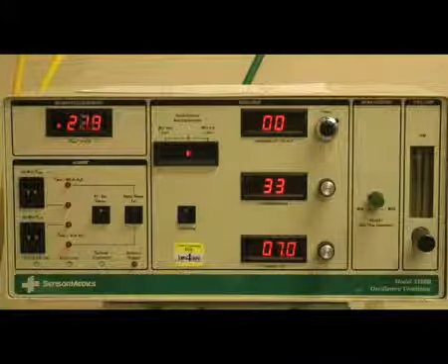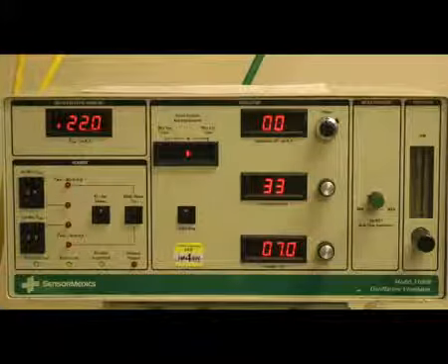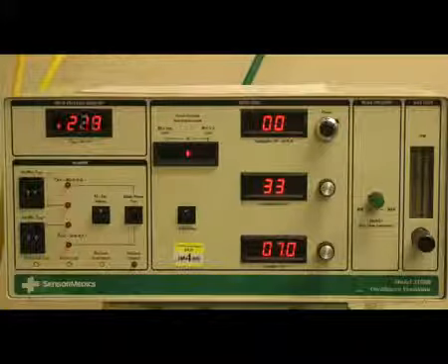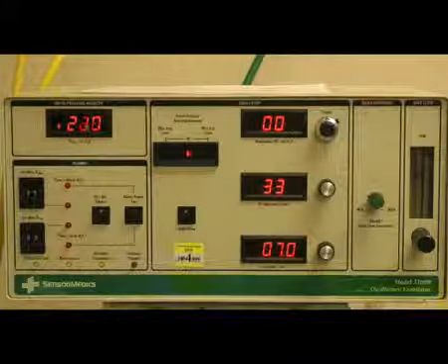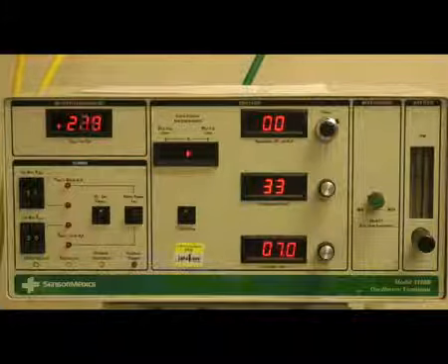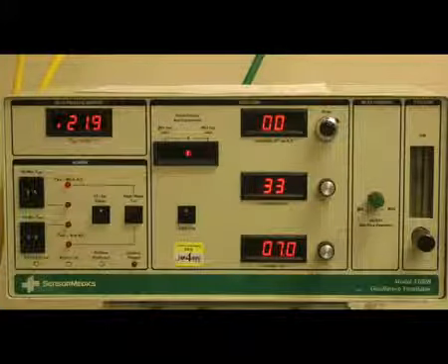However, before you begin, you need to ensure that you have met the indications for high-frequency ventilation. The indications are oxygenation failure, which is defined by an FiO2 of greater than or equal to 0.7 and a positive end expiratory pressure of greater than 14 centimeters of water pressure, or ventilation failure, which is defined by a pH of less than 7.25 with an initial tidal volume of greater than or equal to 6 mL per kg predicted body weight and a plateau airway pressure of greater than or equal to 30 centimeters of water pressure.